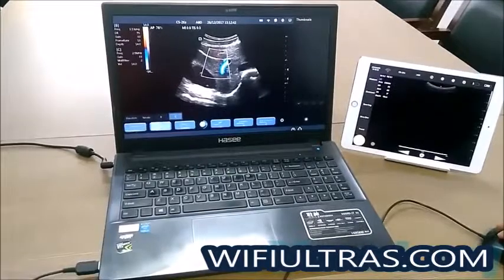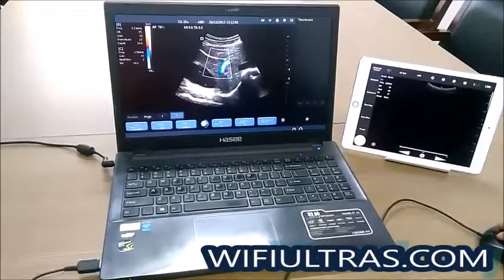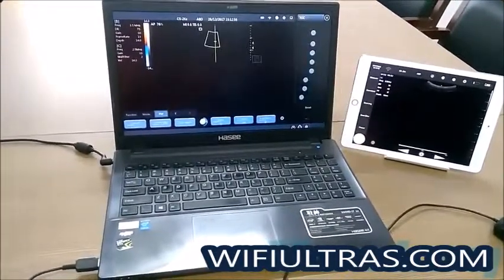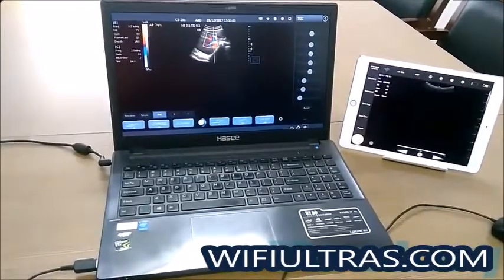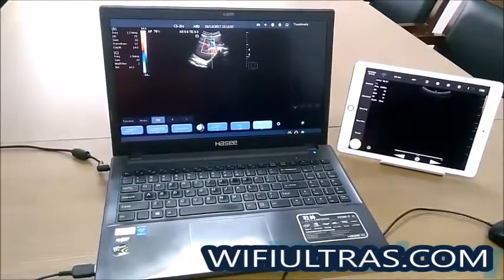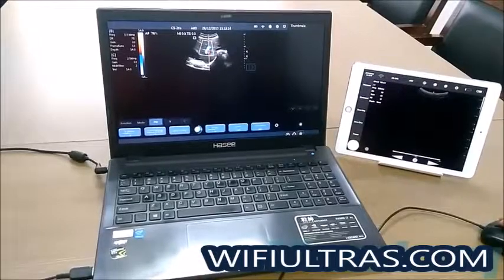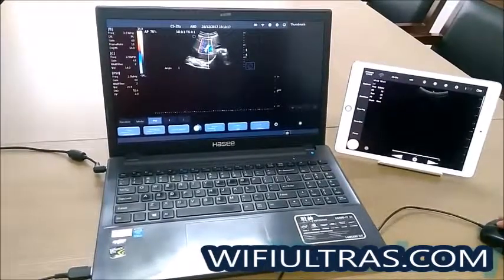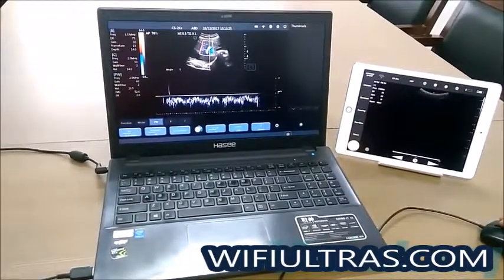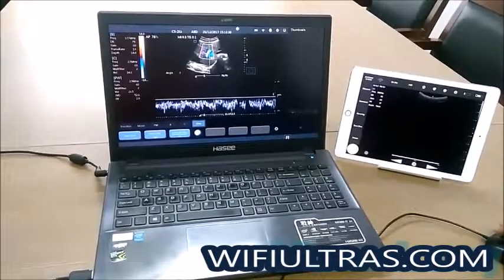Now I'll show you how to enter the Color Doppler mode. You can also change the Color Doppler parameters here. We will now switch to the Pulse Wave Doppler mode. Click update, then press the freeze button.